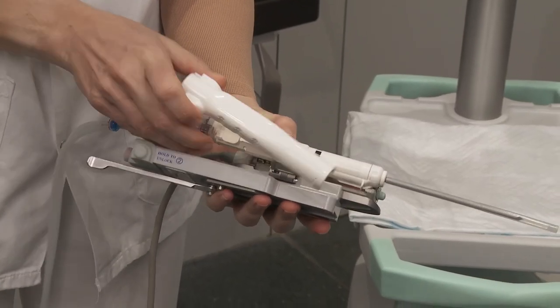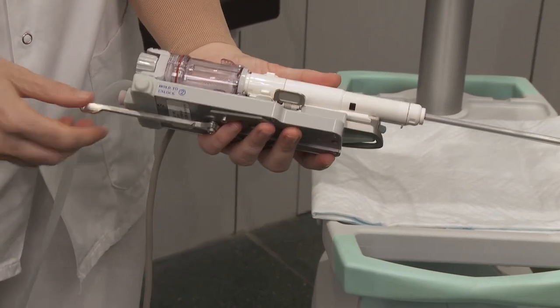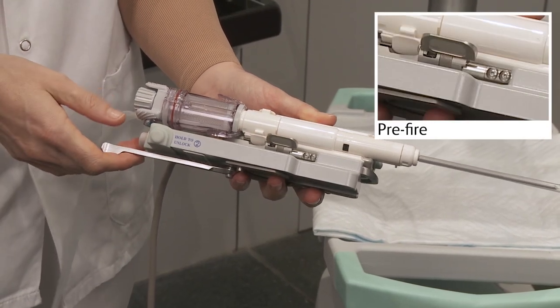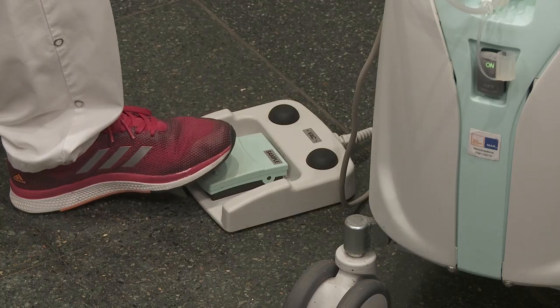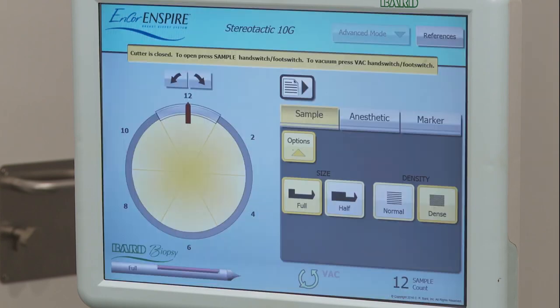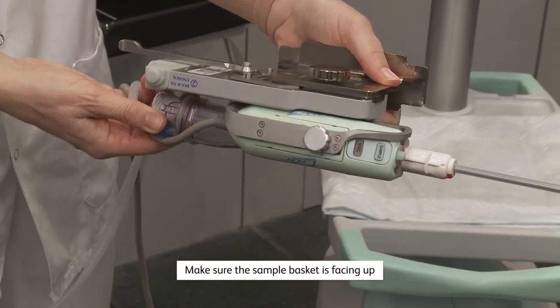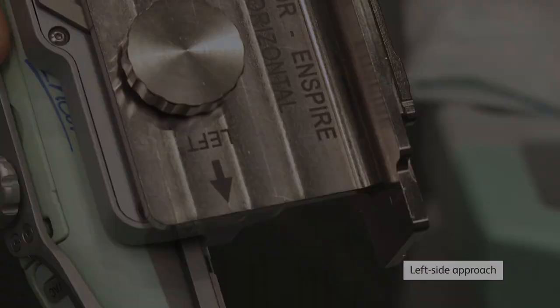Once the EnCor bracket is attached to the driver and the driver to the fire forward accessory, the 113mm 10G probe is mounted into the driver, ensuring it is ready in the pre-fire position. Press the EnCor foot pedal to calibrate. And finally, attach the horizontal approach adapter to the fire forward accessory, following the left side approach. All materials needed for the exam are prepared in advance.